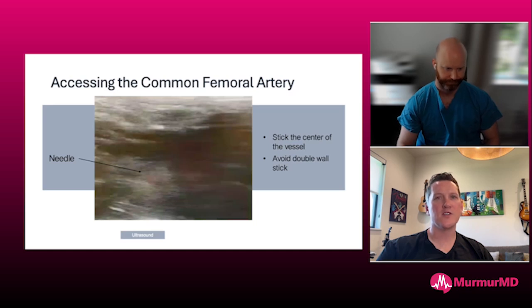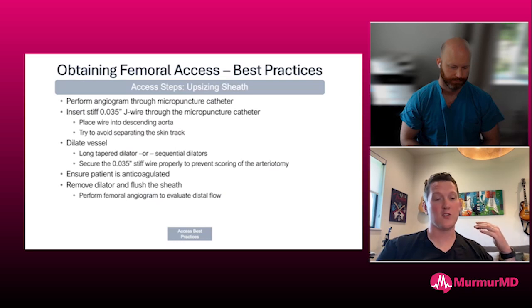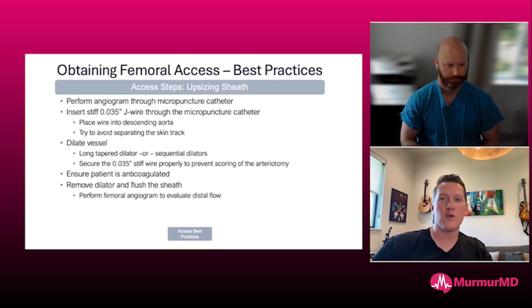Well, I think just a lot of this taking the time to do this right explains some of the discordance in the DanGer Shock data versus some of the other Impella data. Because when a patient's in shock, when they're sick on the table, you're in a rush. And when you're in a rush, you don't adhere to kind of slow best practices. But I think those are the patients you should adhere to it the most in, right? The sickest patients, the patients at the highest risk of bleeding. Those are the patients where, hey, if it takes a couple boluses of epi or neo just to stabilize them while you're getting good access, it's totally worth the time.